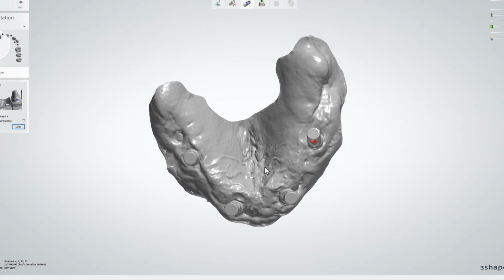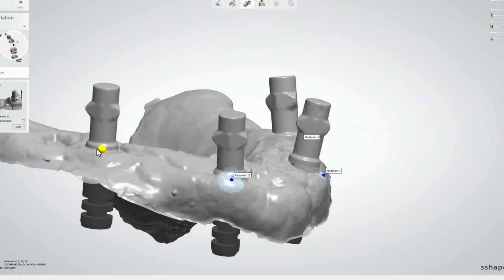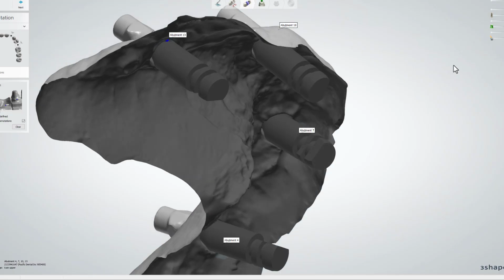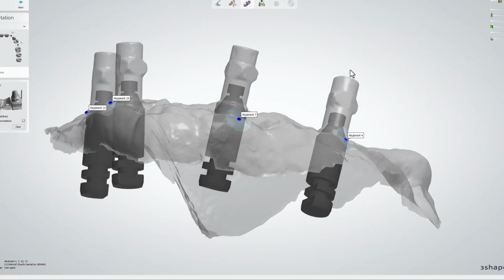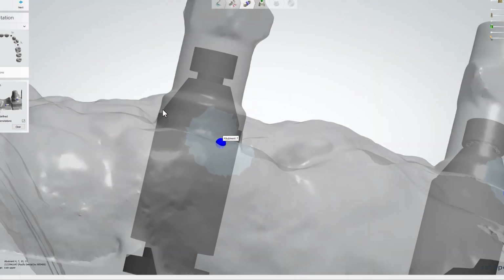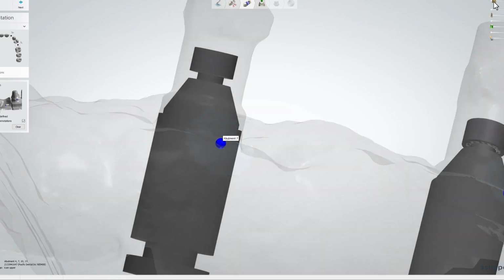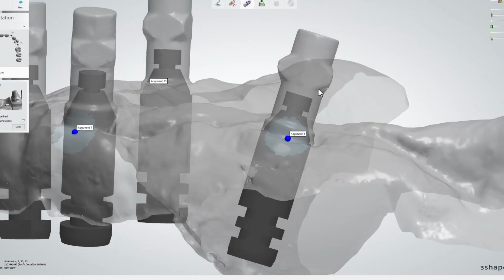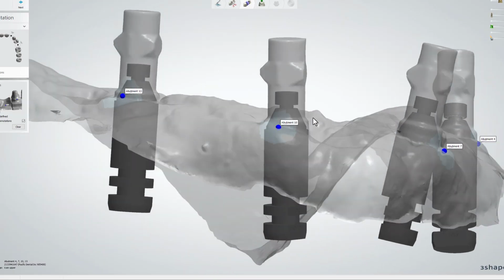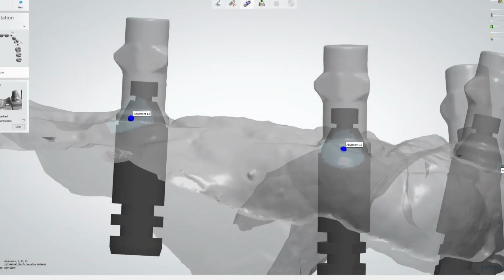So you can see I'm already in. We're going to go 1, 2, 3, 4, and we know that it works. I'm happy with this. It's actually making progress, and you can see right here where the scan body comes and aligns. That's the top of the MUA right there. That's pretty solid. This is already, right off the bat, amazing. You can see where everything is.